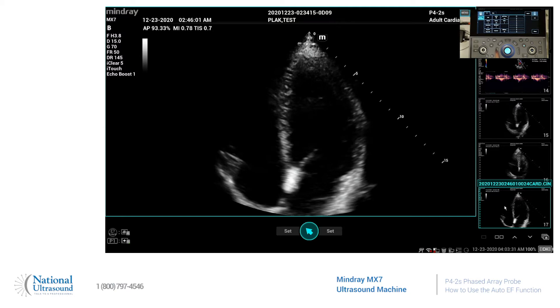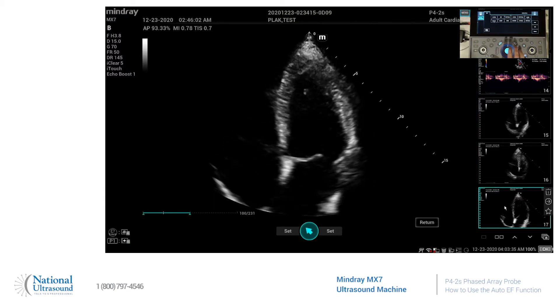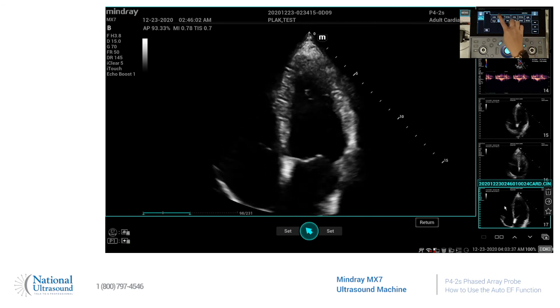So what you'll do is first you'll pick your image, double click it, and you will go to Measure, click AutoEF, and you have to be a little patient — it takes a little moment.